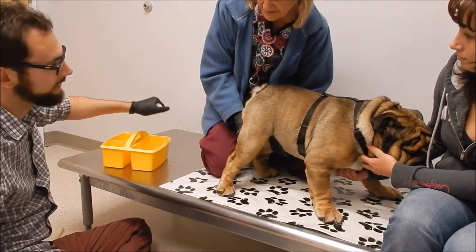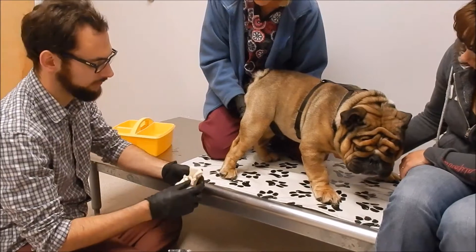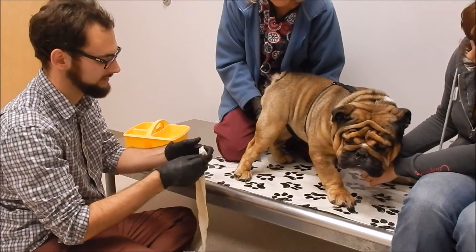We're going to do a cast on Zeus today. Zeus is a little scared, but he's a nice English Bulldog that we're doing a brace for. He's got a CCL rupture.